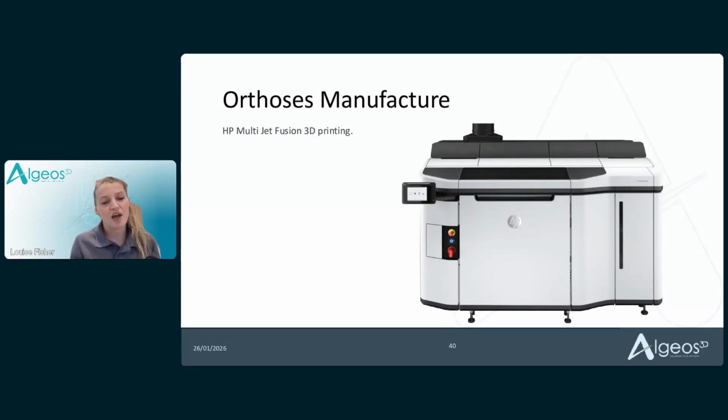How they work and how they print is different, and different printers can print different materials. So that is a space that you might want to go and explore further. But for the purposes of today's talk, I'm letting you know that our Algeos 3D products are printed in the UK with an HP Multi Jet Fusion 3D printer using PA11 materials.